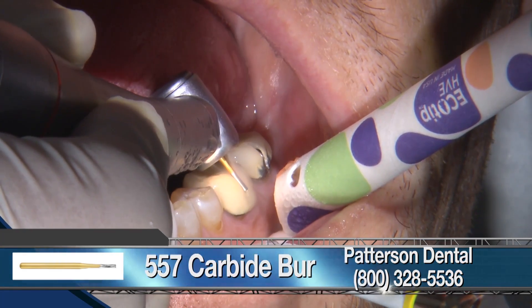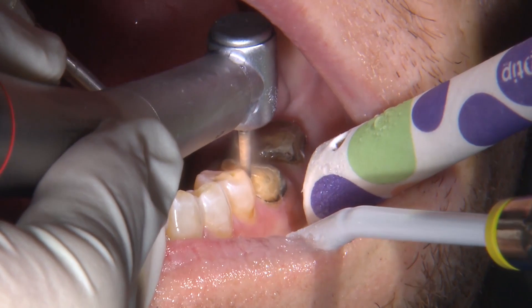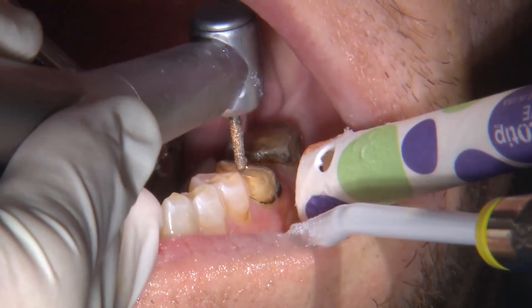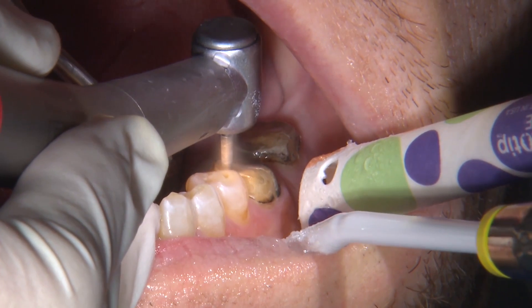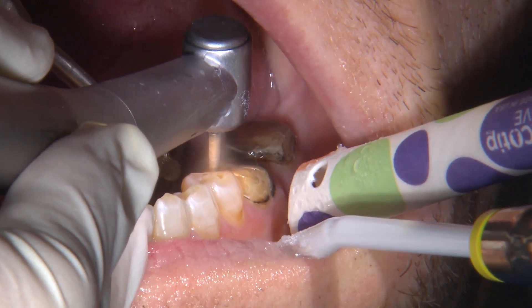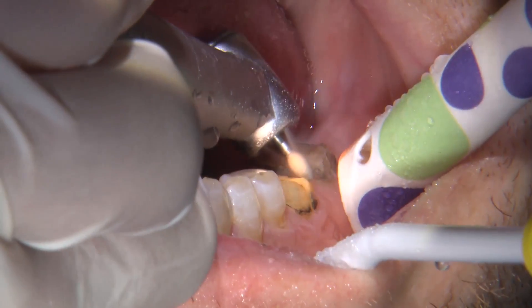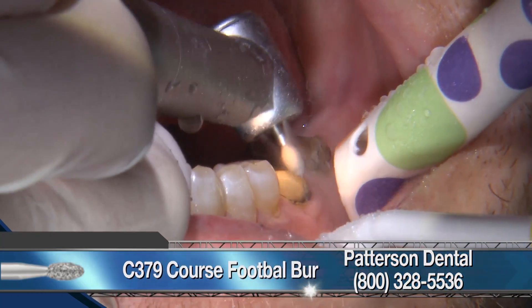Here I'm using a 557 carbide burr. Once the crowns are removed, I am clearing out the interproximal areas. Everyone has their own preference when it comes to preparation. I just prefer to get the occlusal reduction taken care of first and then moving on to the axial walls. Here I'm using a coarse football to reduce the occlusal surface.